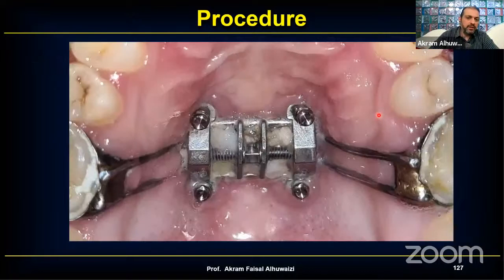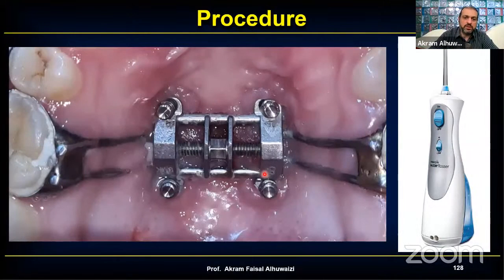But cleaning them is also an issue. After I finish the insertion, I would usually advise the patient to clean them very well, brushing them, mouth rinsing, probably even having the aid of some other person in the family cleaning them for them is not a bad idea. But a better approach would be to use these water flossers and just try to clean them with water flossing. As you can see, just by water flossing it, it became so clean. So I always advise my patients to use these water flossers.